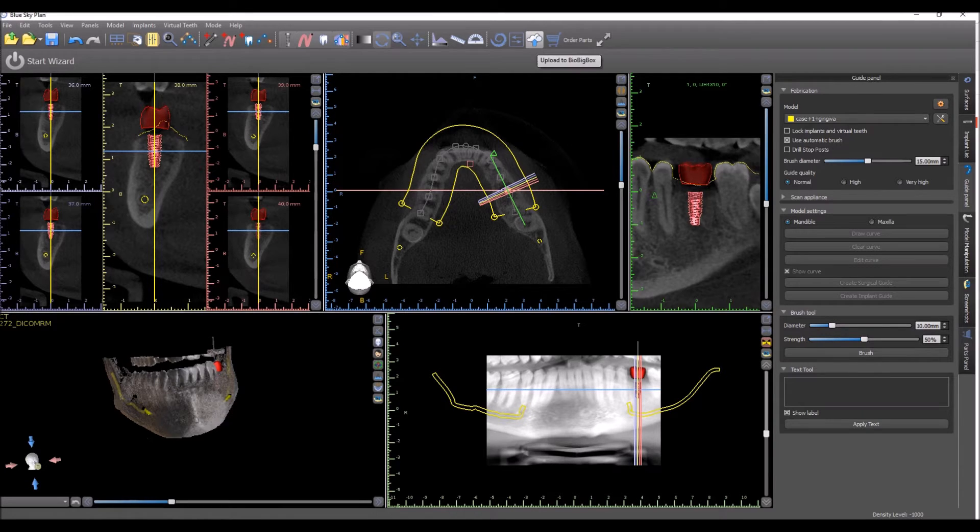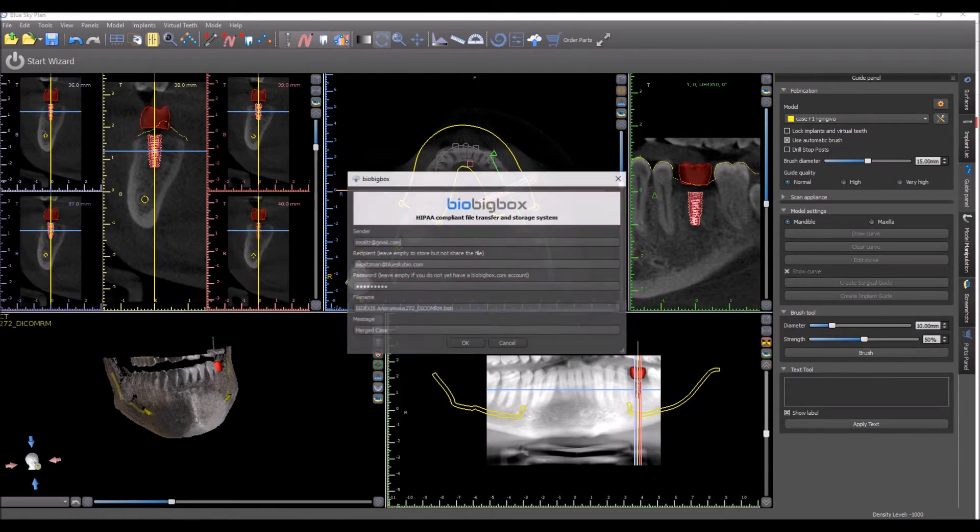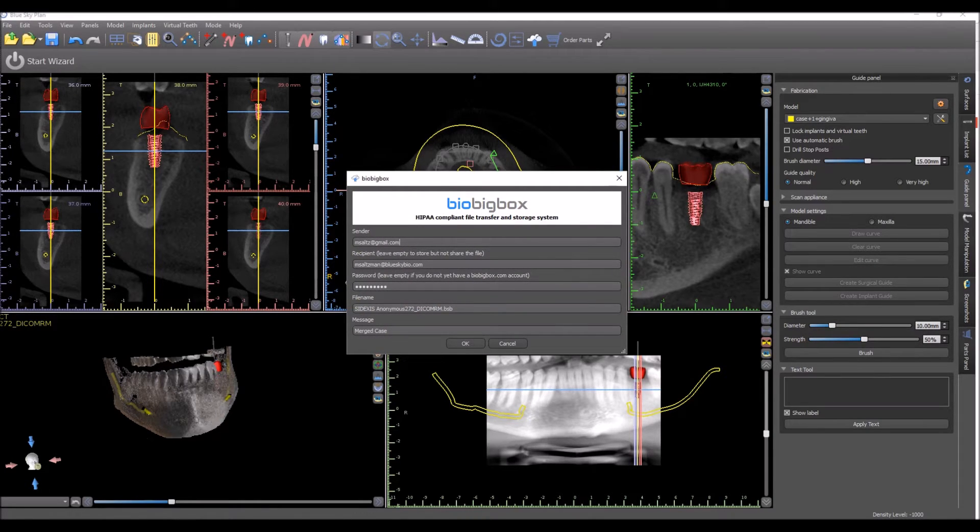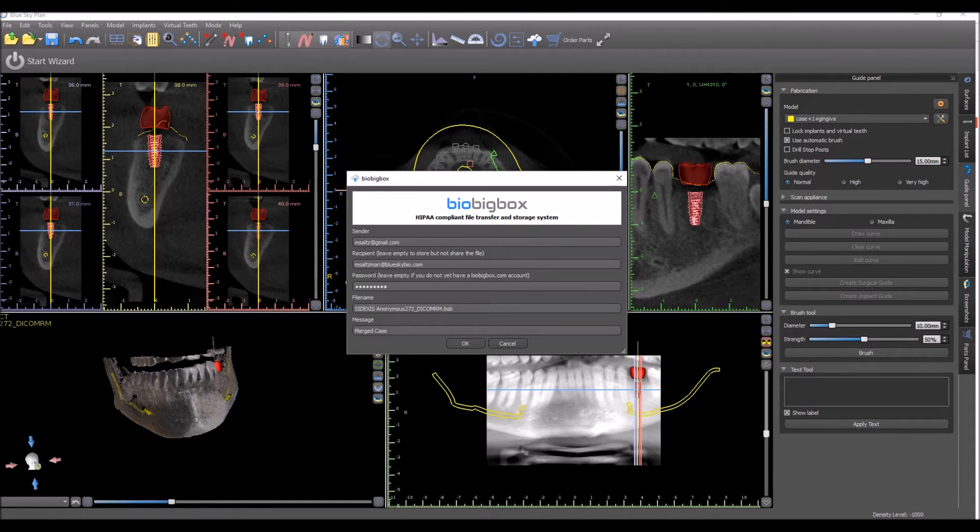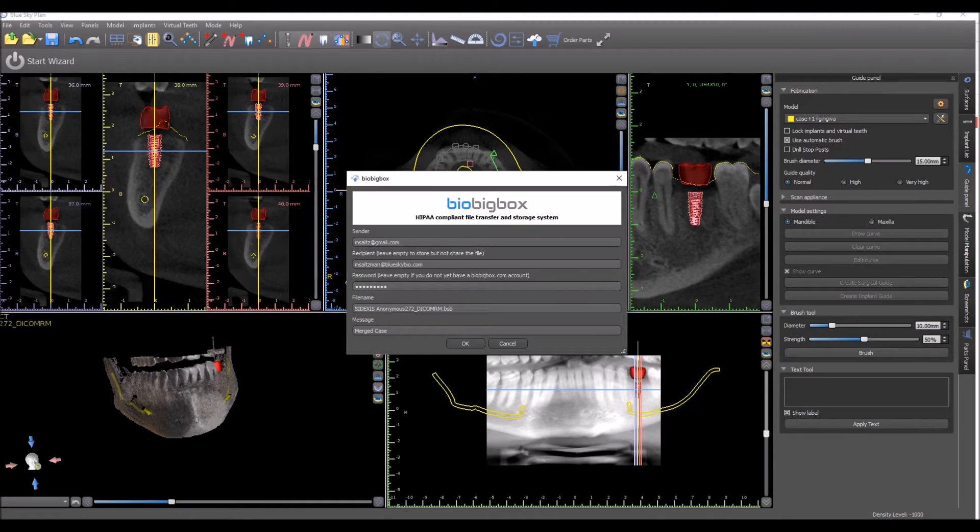Once you click this button, you have a send form. Put in your email address as the sender. This should be the same email address that you use to create your BioBigBox account.